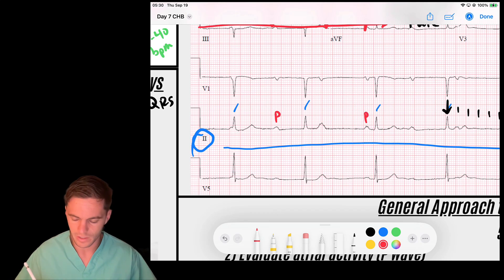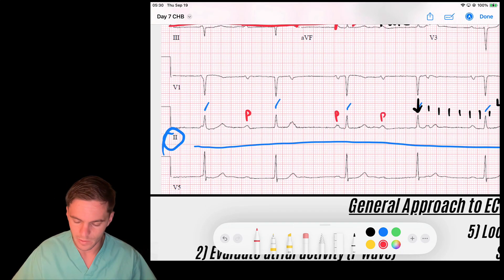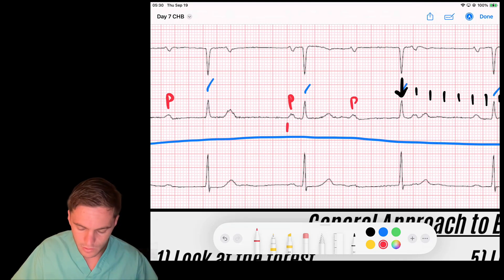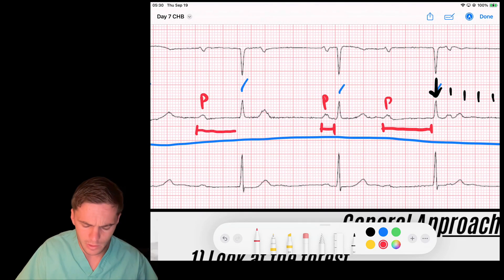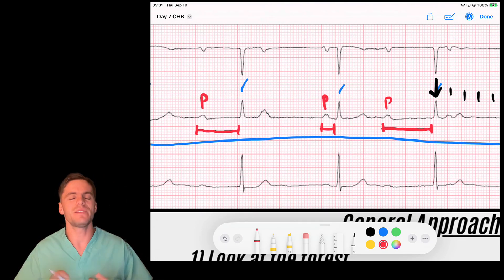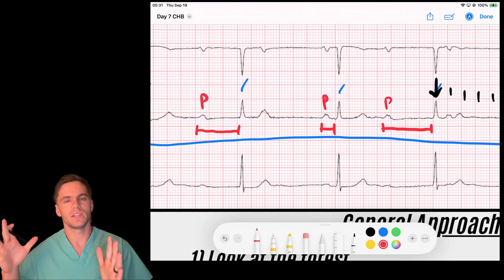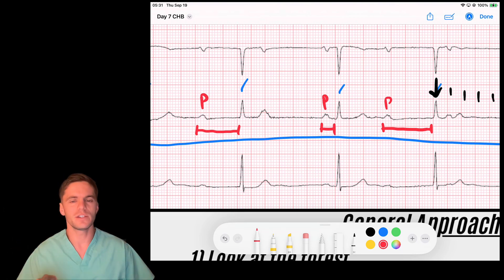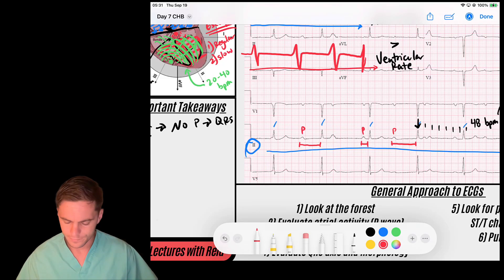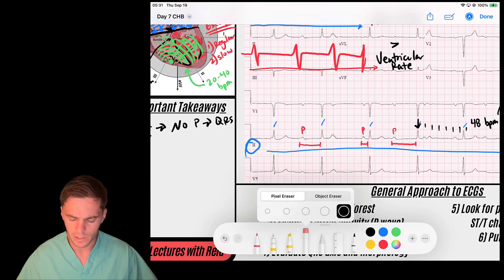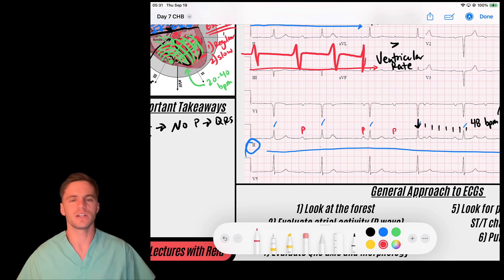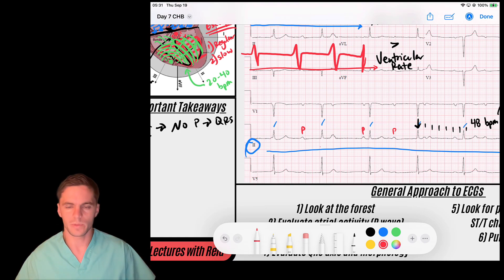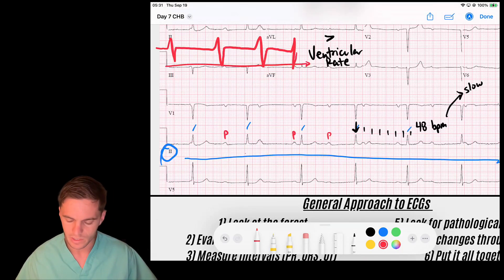I notice there are P waves, but the distance they occur from the QRS is not the same every single time. When assessing the AV junction I'm assessing the relationship between P waves and QRS complexes, and I see variation there. I also notice my QRS complexes seem irregularly spaced relative to the P waves, which really concerns me that we have a complete heart block. So I ask myself: can I map out the P waves?